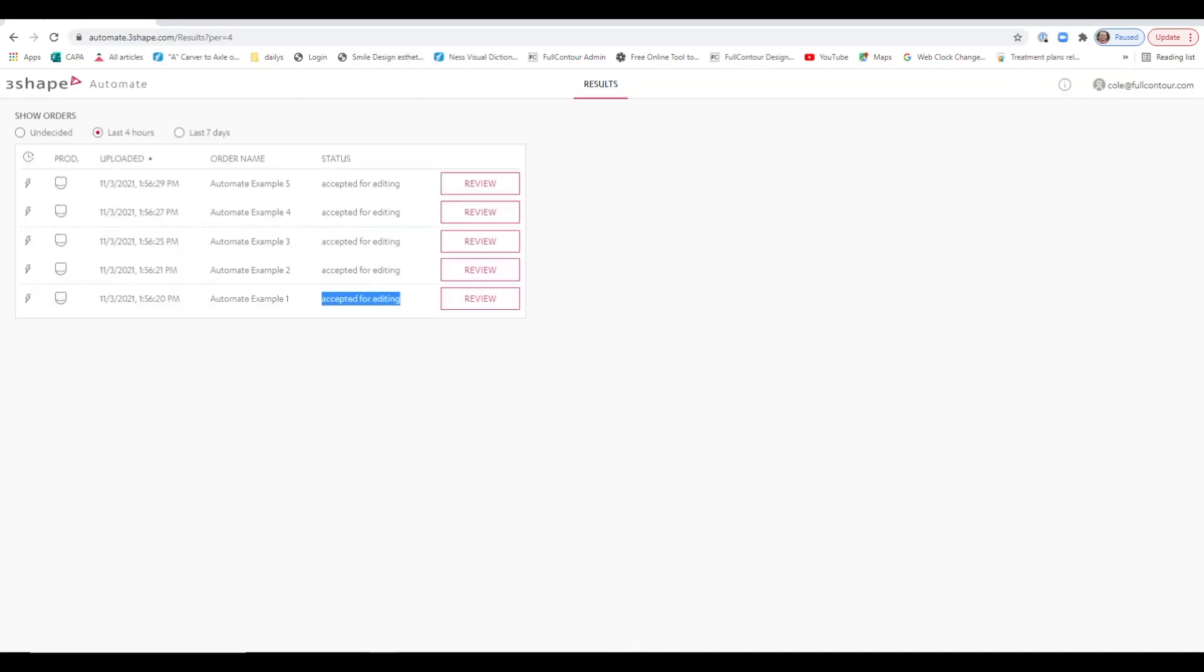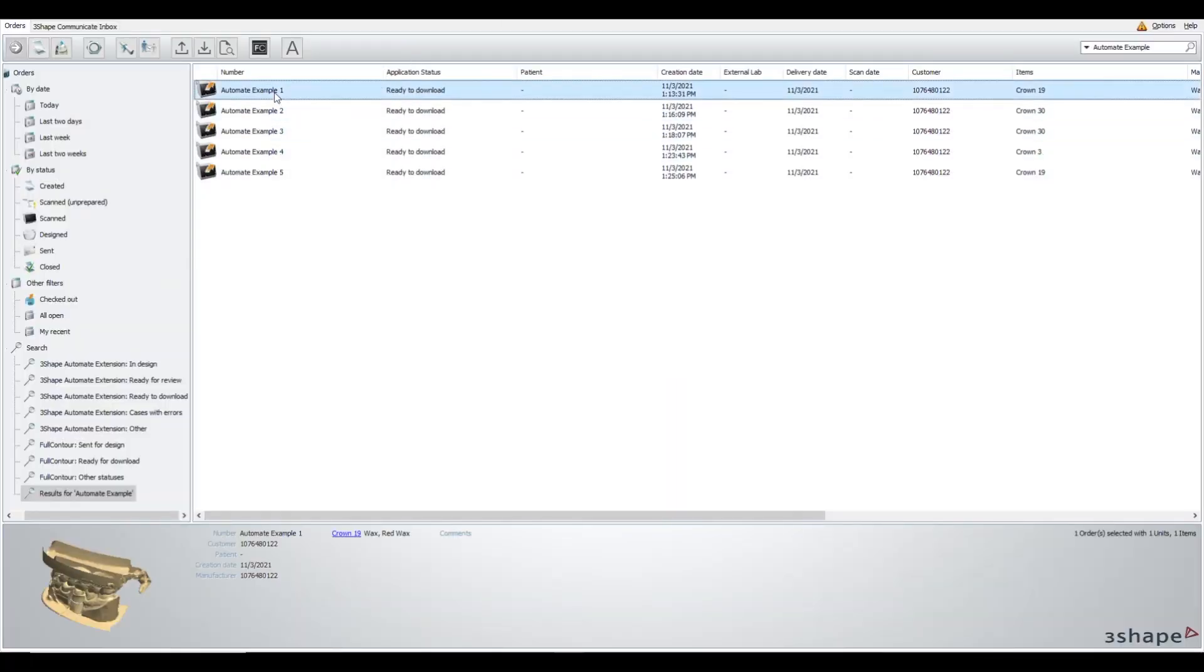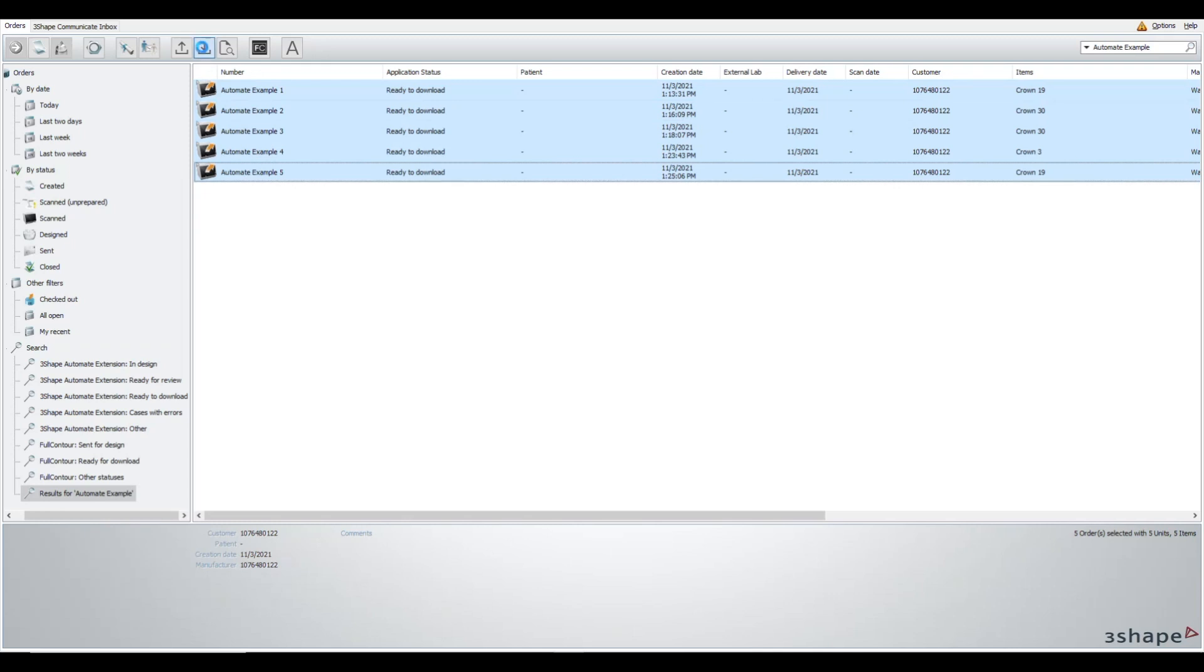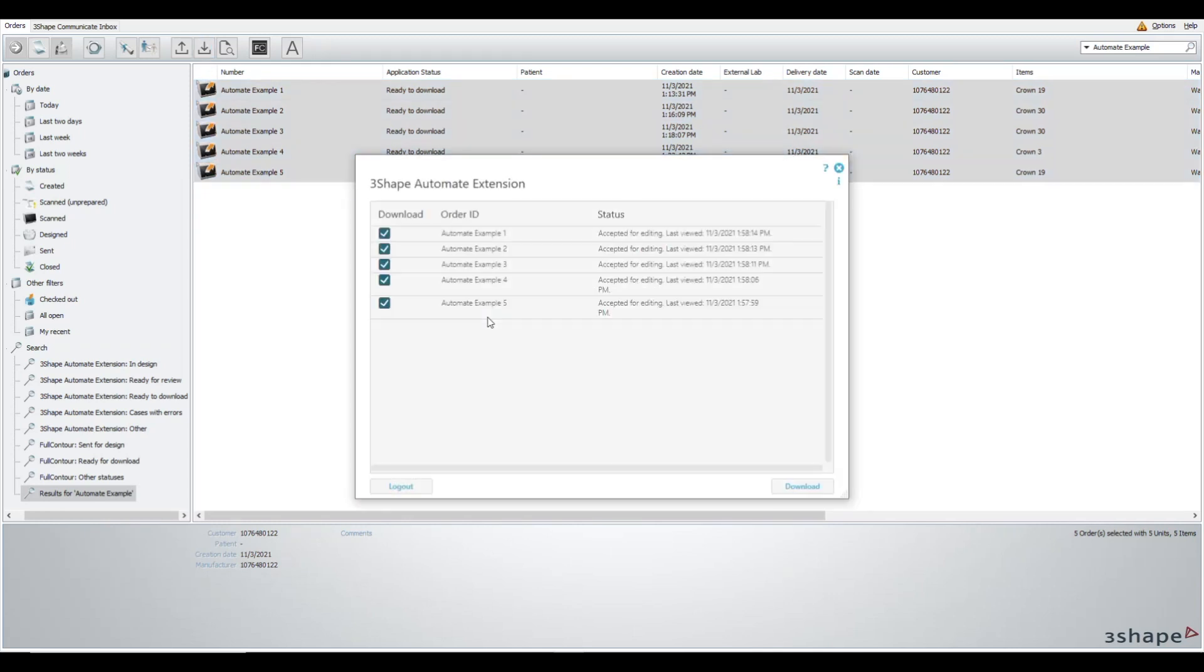After you accept them for editing, you'll see the status change, which will also change inside of Dental Manager. Here in the application status, you can select them all, click the download button.